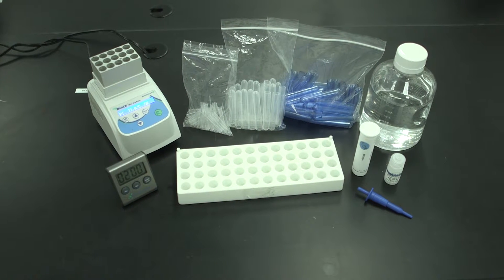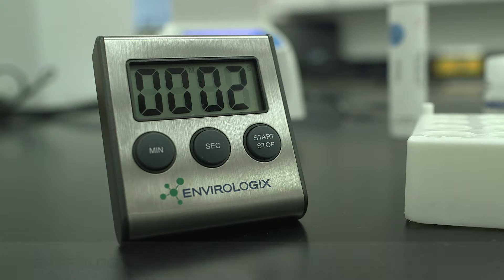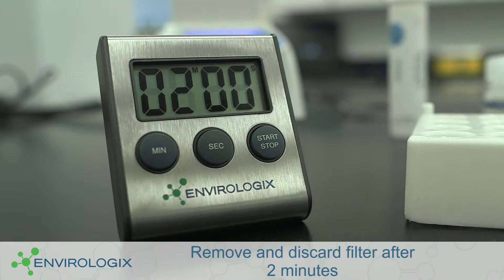Extra tubes and pipette tips are needed when running dilutions. Also, if clarifying the sample using the filter method, remove and discard the filter after two minutes.